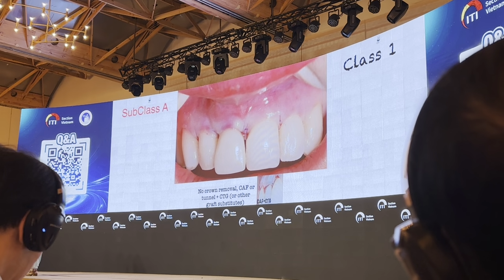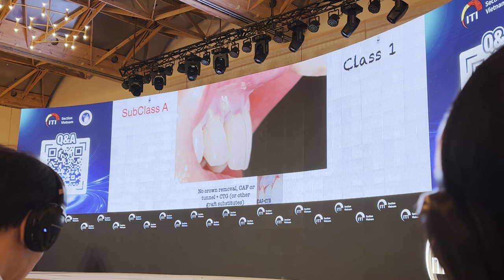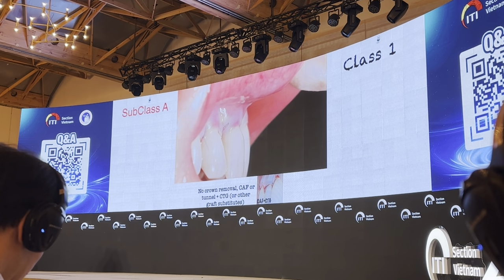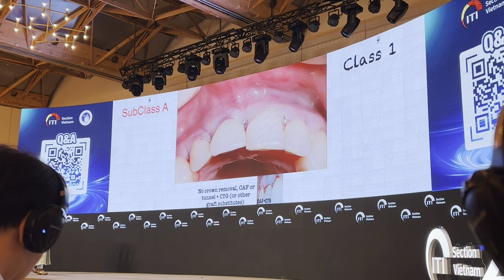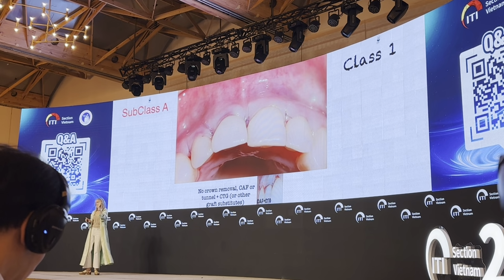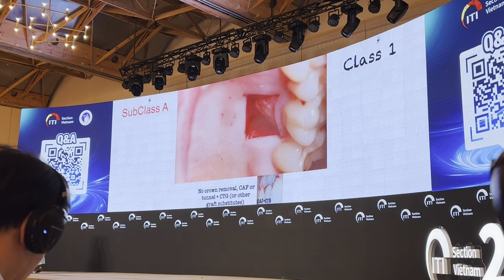The mucosal margin at the level of the implant supported restoration is coronally displaced to cover the connective tissue graft that is going to remain completely covered and is going to increase the soft tissue thickness that is going to mask the transparency for this patient.